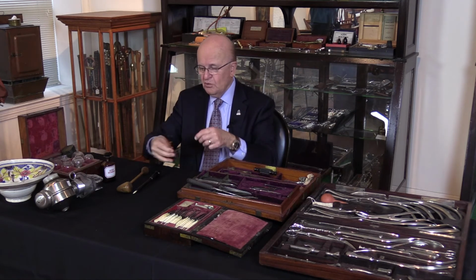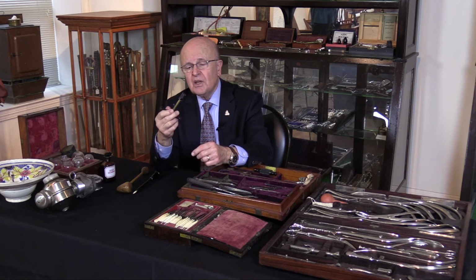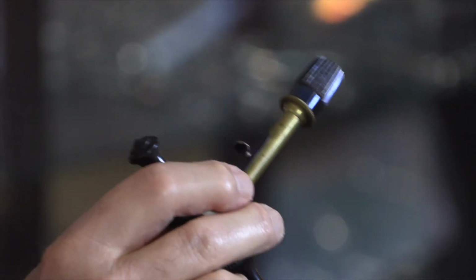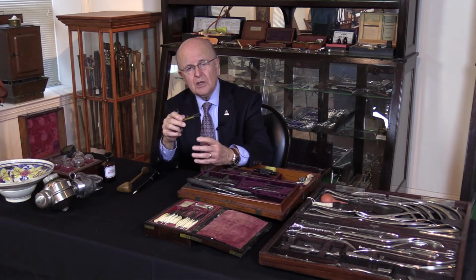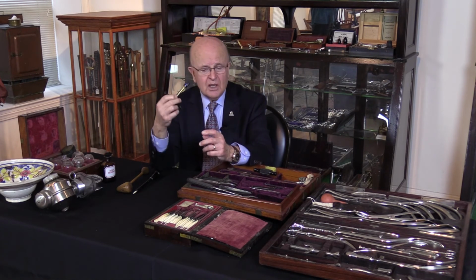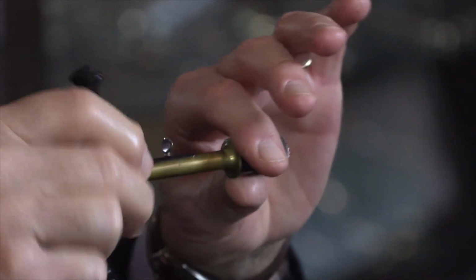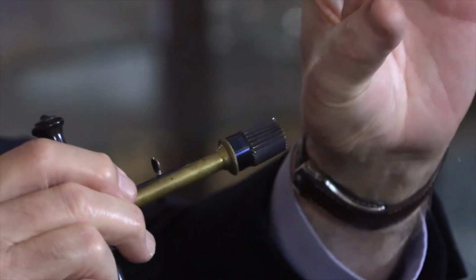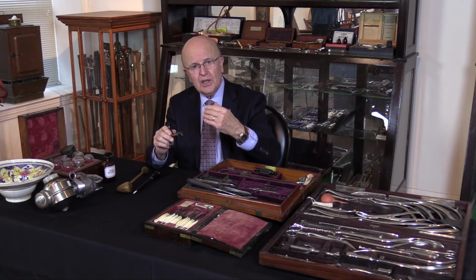One more thing from the neurosurgical collection is what they call the circular saw. If a patient had a subdural hematoma and the hematoma is getting larger and starting to press against the brain, they would cut the soft tissue and on the skull move the saw back and forth, and a piece of circular bone will come out. They used to call it the biscuit. Then they drain the blood.